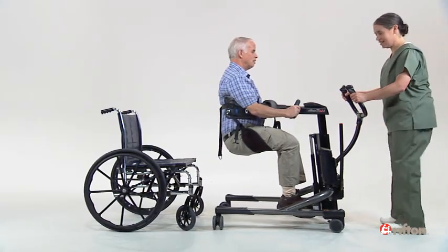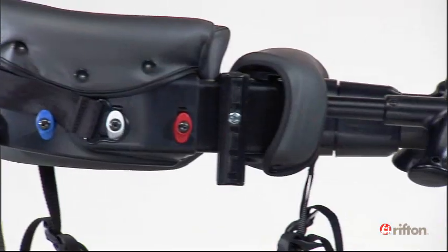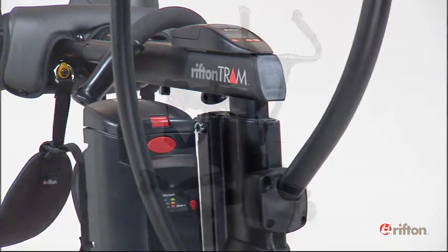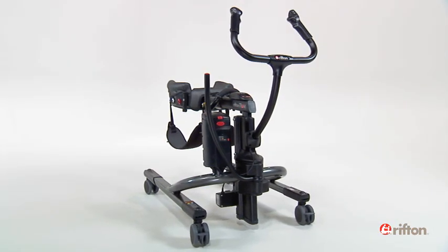With proper use, the Rifton Tram can eliminate caregiver lifting, reduce back strain and workplace injuries, and give dignity and safety to the client. Here we will demonstrate the appropriate technique for a seated transfer.